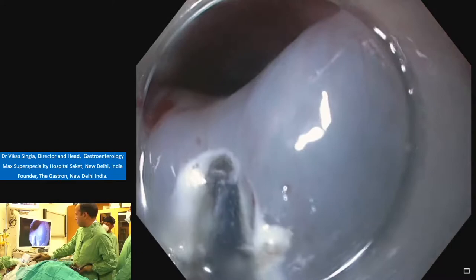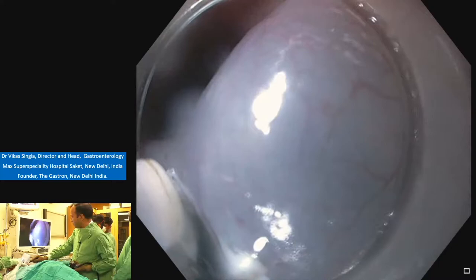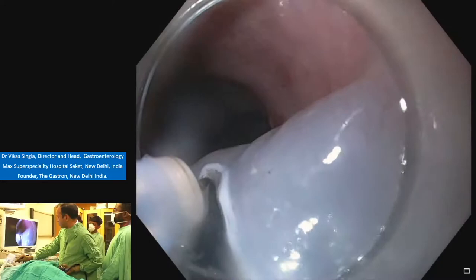We can see the blue appearance of submucosa. It means the depth is adequate. Then at the apex we go deep inside, lift the knife, and again coagulate and then cut. So we are cutting in the anterograde direction. Again go below the apex, knife out, lift the mucosa and then cut. Initially coagulation, then cut.